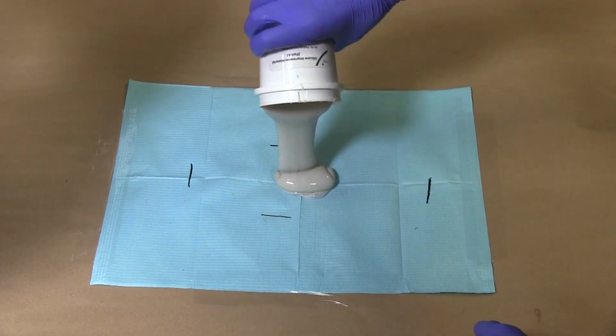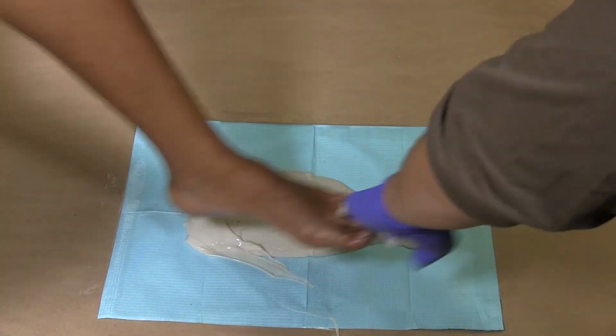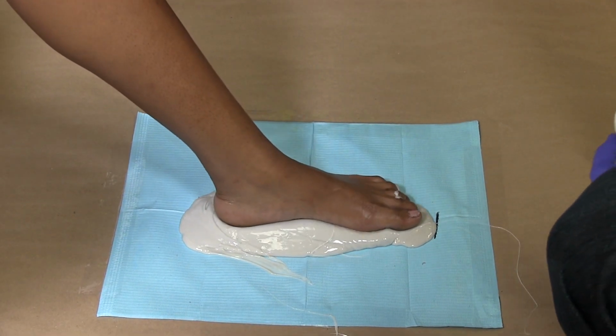Do not place the customer's foot in the impression material right away before it becomes tacky. This will cause displacement of the material and result in an impression that is too thin.